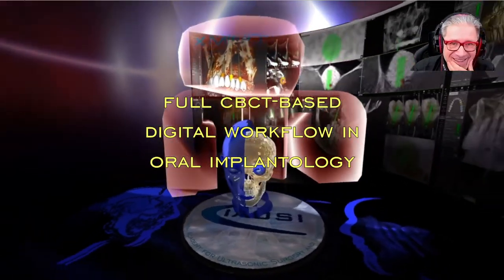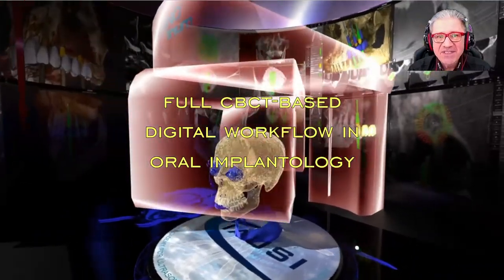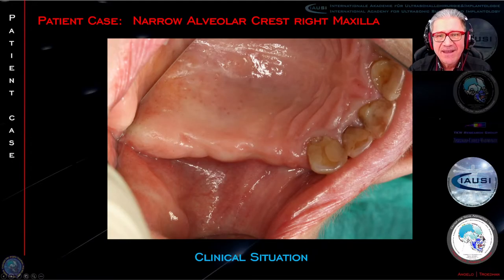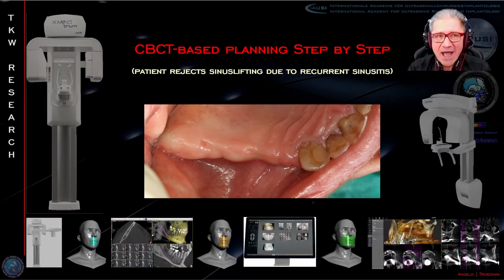So let's take a look at how a full CBCT-based digital workflow in oral implantology works. We take a very, very common case, which is the clinical situation up here from the lady. It's a very, very narrow alveolar crest in the right upper maxilla. So how does the CBCT-based planning work step by step?